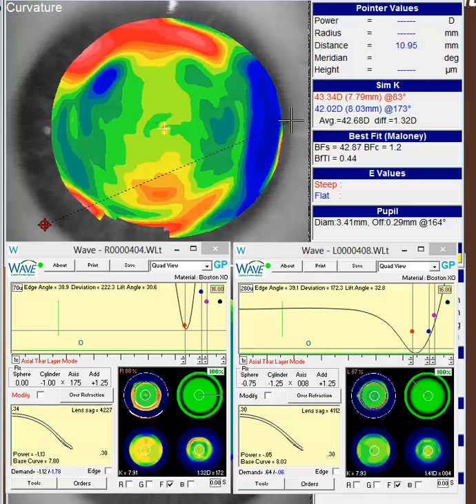Obviously, if there's no physiological concern with the lens and it's comfortable, you may be okay even though you have a little larger lift on this lens. You may not have to make a whole lot of design changes.